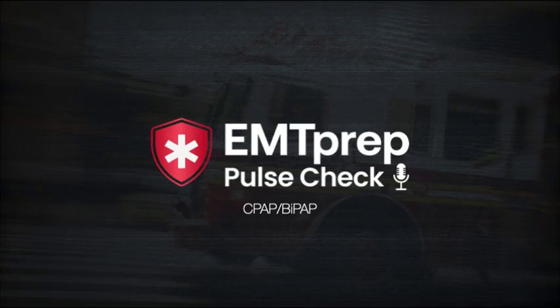So things to consider for this patient. What setting should we start off with on BiPAP for pulmonary edema? Well, one thing we want to do is start him off on that 10 and 5 IPAP and EPAP. We can put him on spontaneous, or spontaneous and timed and have a mixture of both and maybe try to coach his breathing. If we need to make any changes to our IPAP and EPAP, maybe his SATs aren't coming up with what we got him on, remember, we'll increase that 10 and 5 by 2 centimeters of water, and we'll keep that gradient the same.